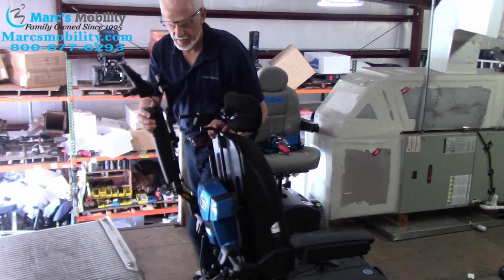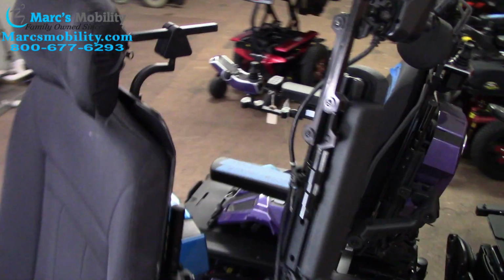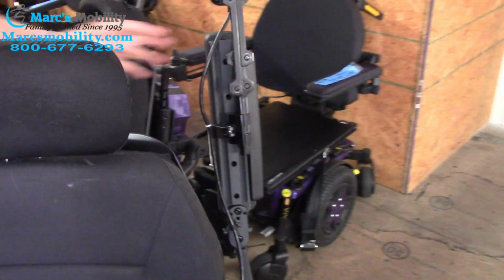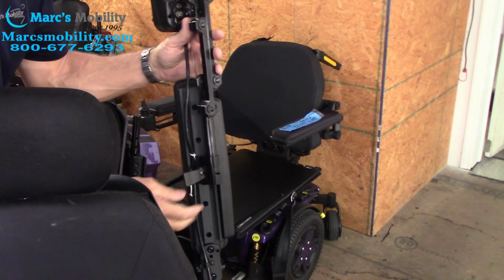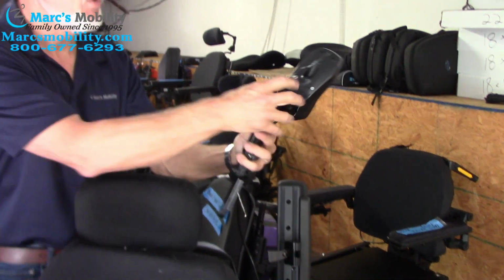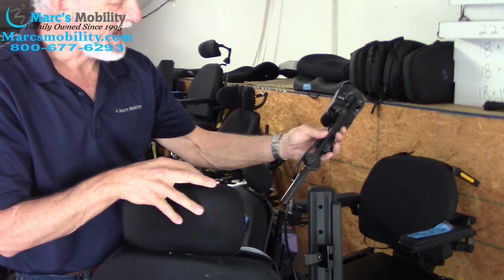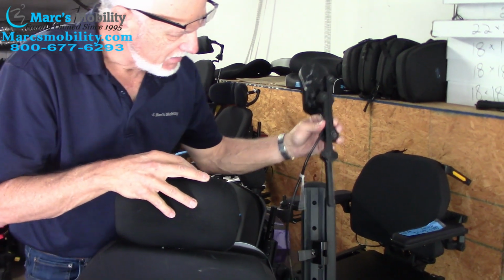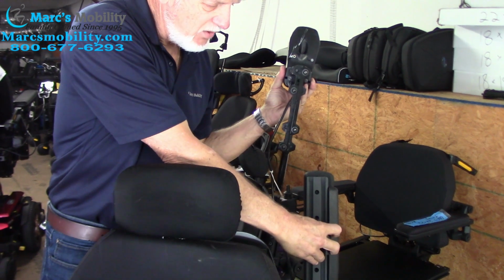If you look at the bottom of this arm right here, if you need to take it off, you just lift the lever right here, lift the lever, and the joystick comes out. Okay, so if you need to take it out to mount it on your bracket, to put all these screws on your new joystick, just take it out. You can put it back in here like this, and I'll have this already on there for you.